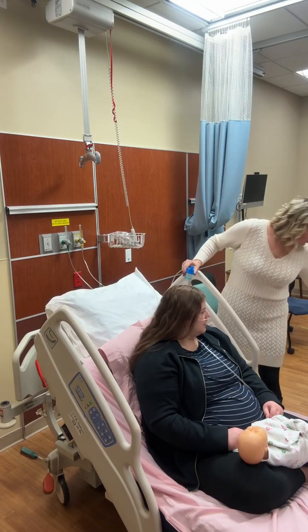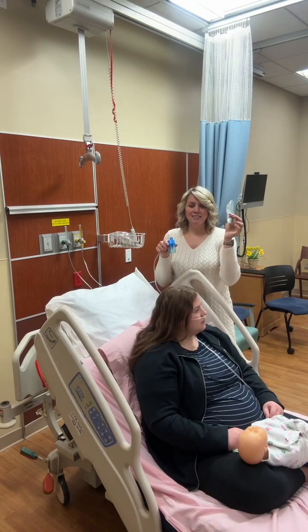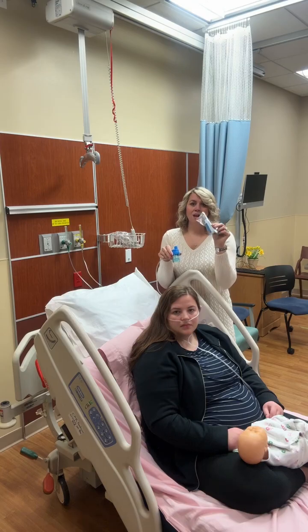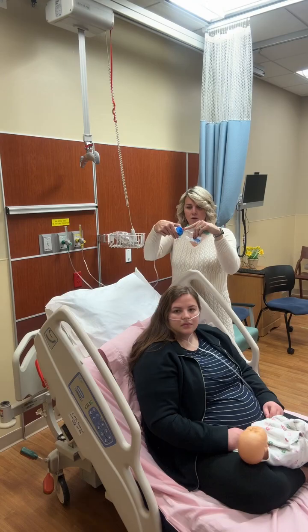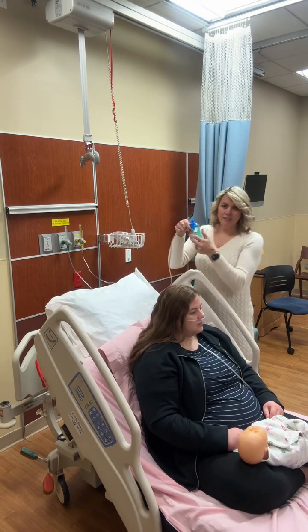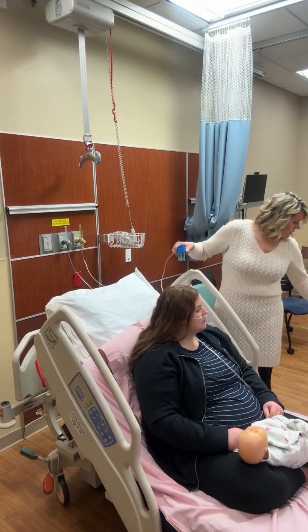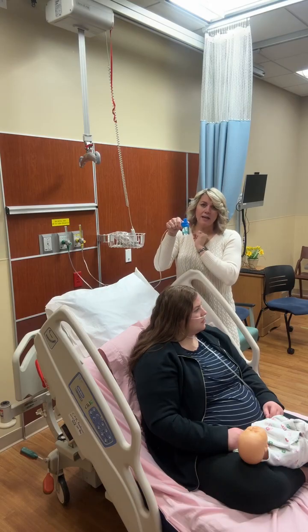So I'm going to figure out what my medication is. I'm going to do my 3 med checks, and I'm going to pretend to put my unit dose in SimLab. In most situations, all of your nebulizer medication is going to come as a unit dose. So it's going to tell you how much is in the little vial here, and you're going to open it and pour it into the hole that goes into this cup. Okay, you don't have to take the top off. That just makes it easier to drop or spill. So we're going to pretend that I did my 3 med checks and I put my medication inside the cup.